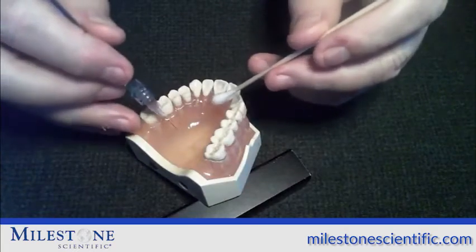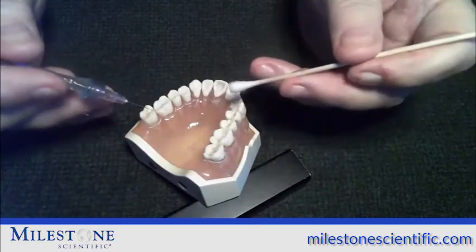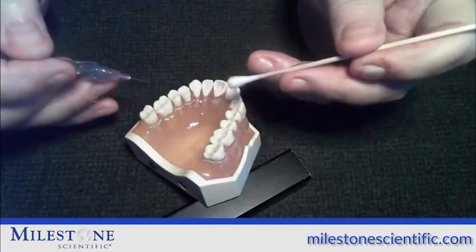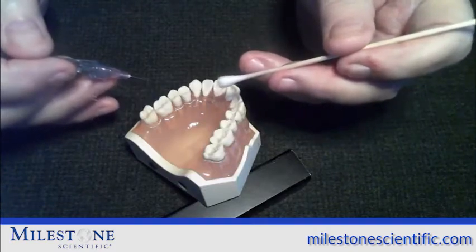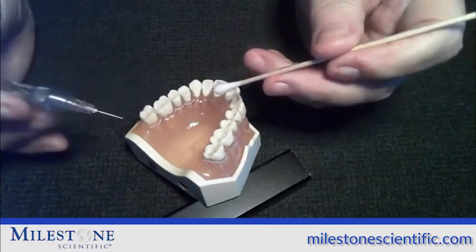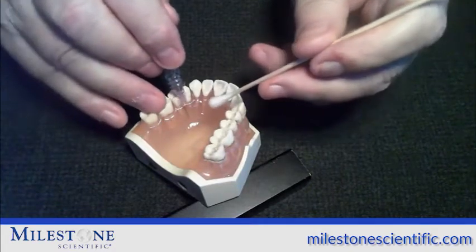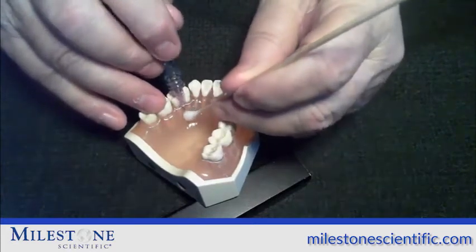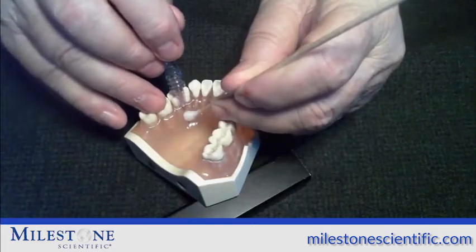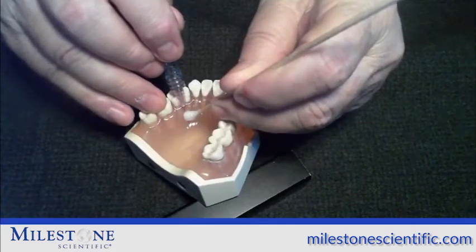The AMSA injection is a very comfortable injection that's going to anesthetize multiple teeth. It has three different stages. The first stage is to pierce the tissue. The second stage is to penetrate through the palatal tissue to the palatal bone and deliver the anesthetic comfortably. To start the injection, we find the bevel of the needle and use a pre-puncture technique. We lay the bevel of the needle against the tissue, then with the cotton tip applicator put pressure on the back end of the needle and on the tissue. We then start the flow rate by hitting the foot pedal, holding it down until we hear the voice say cruise. When the voice says cruise, we take our foot off the foot pedal.